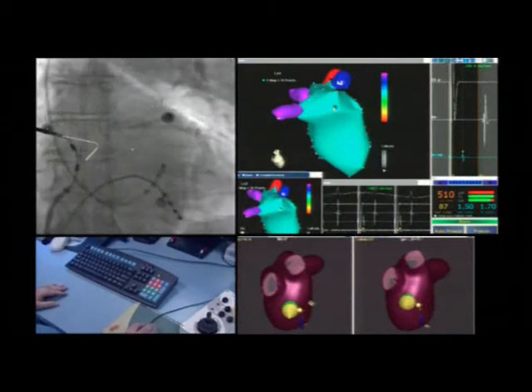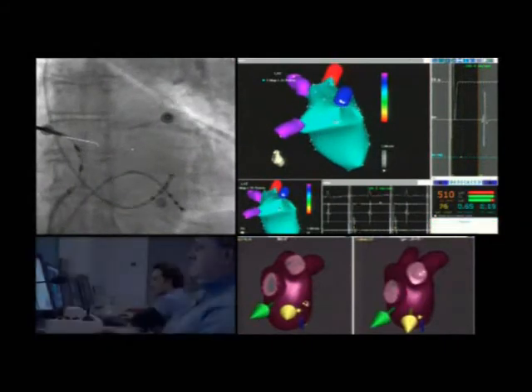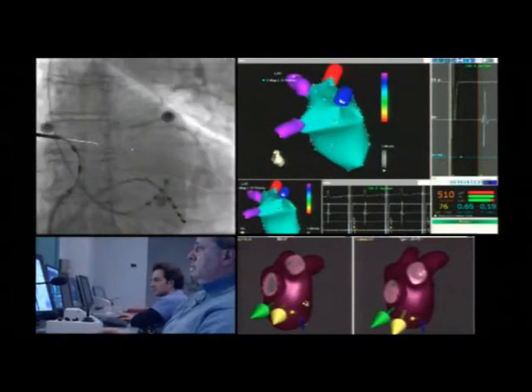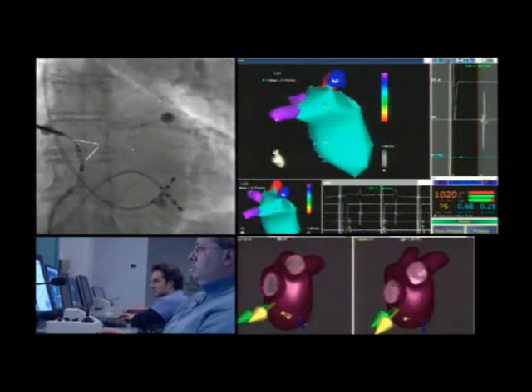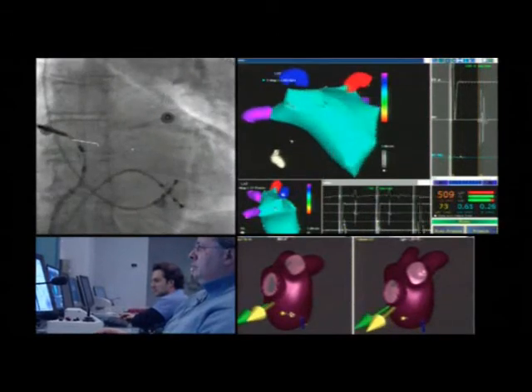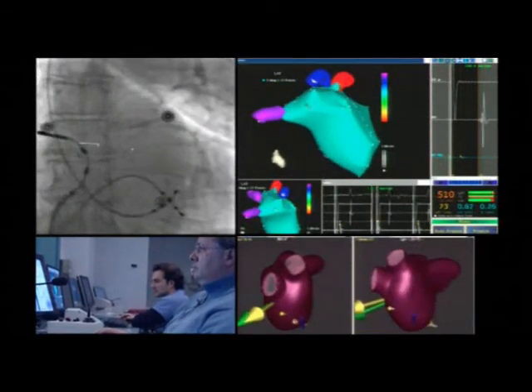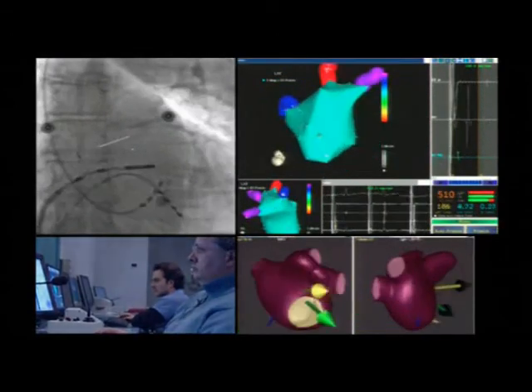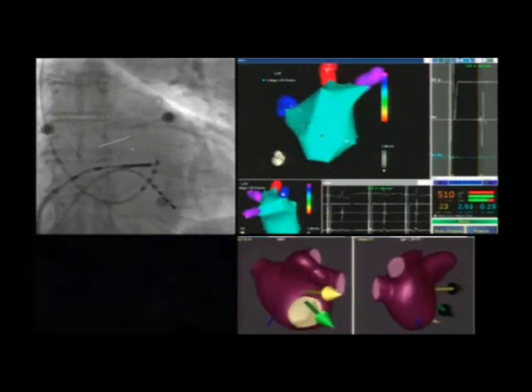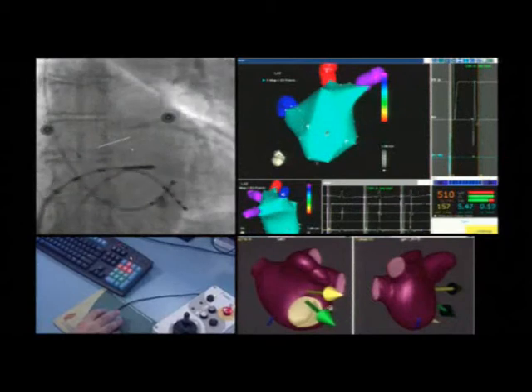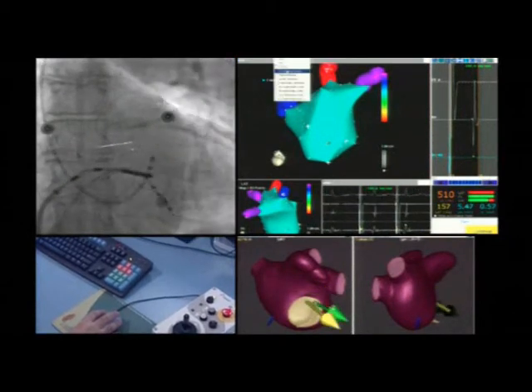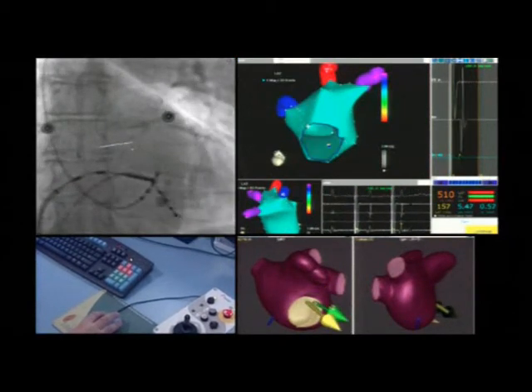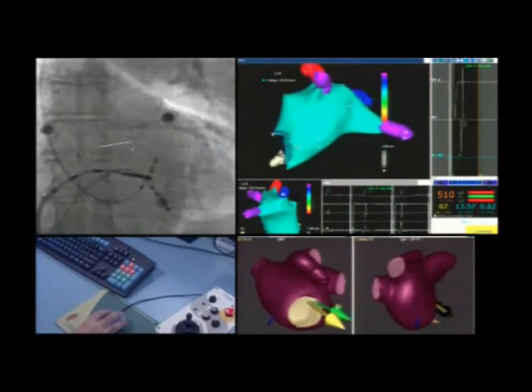The last region to be mapped is the mitral valve area. The reconstruction of the mitral valve is difficult when using the standard manual approach, since the movement of the leaflets greatly limits the acquisition of the points of the annulus.